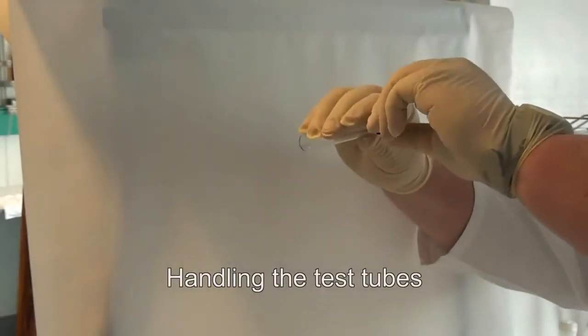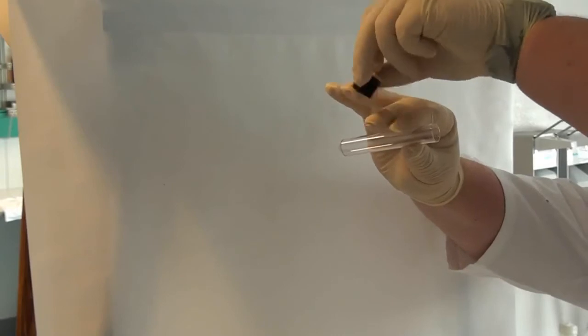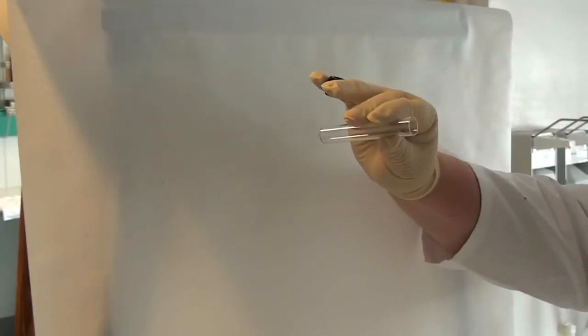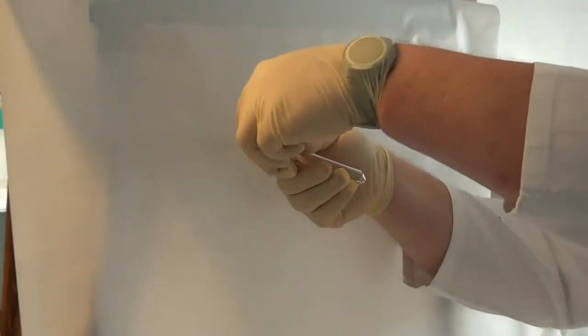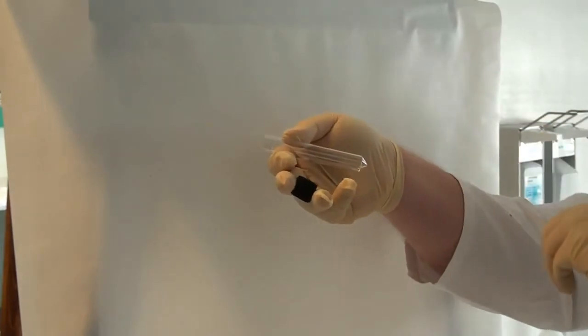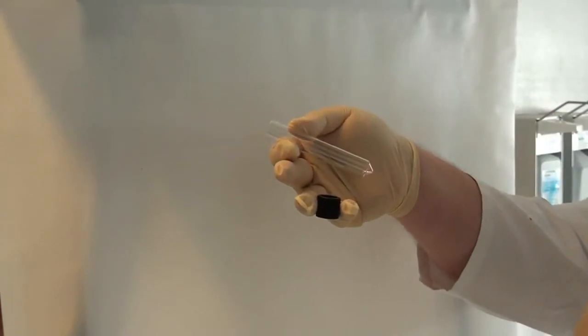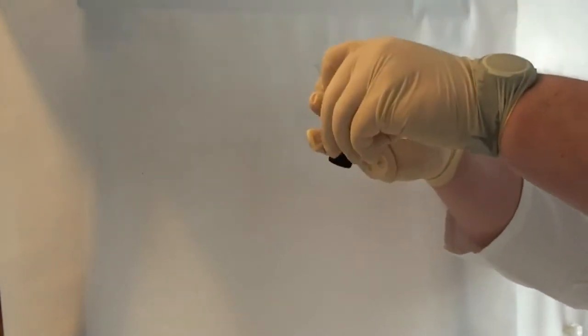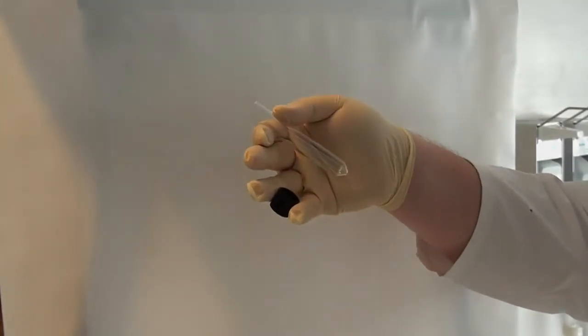Sterile test tubes have to be handled with care. As dirt may trickle from the udder, tubes should be kept in a horizontal position most of the time, and the plug should be protected with the hand either like this, or like that, having the plug pointing downwards. But neither in this way, nor in that way, having the plug pointing upwards, because there is the risk of contaminating the plug.